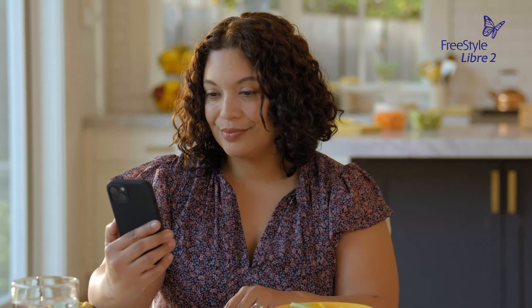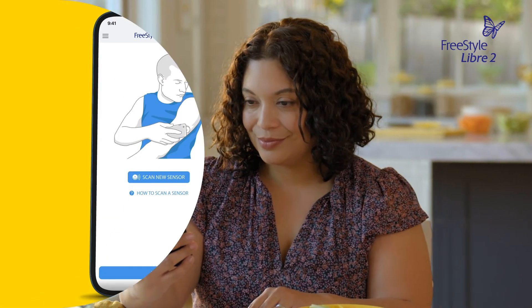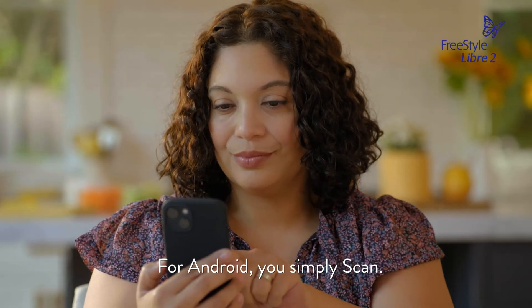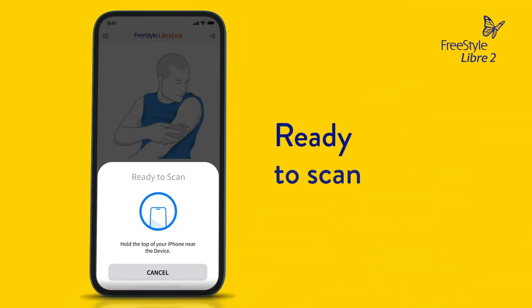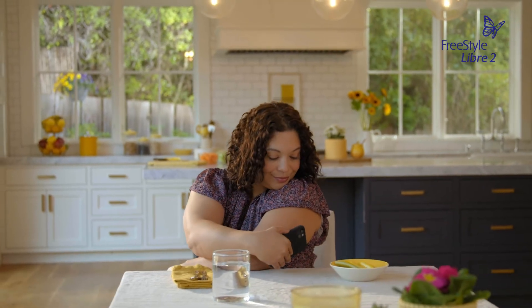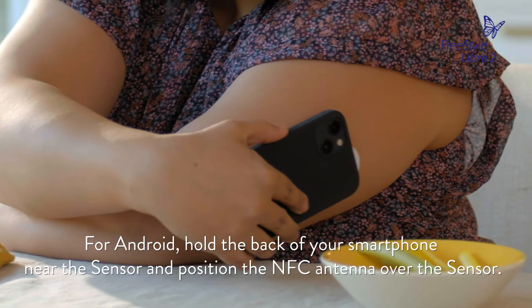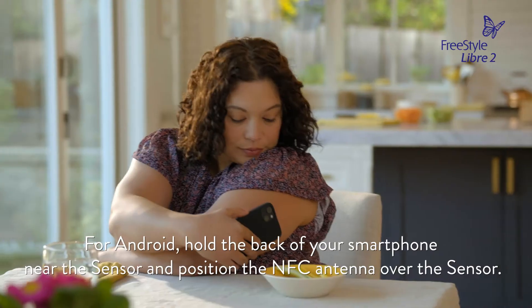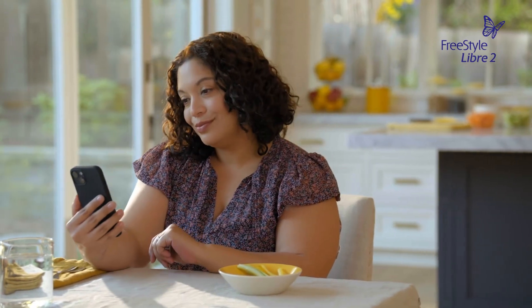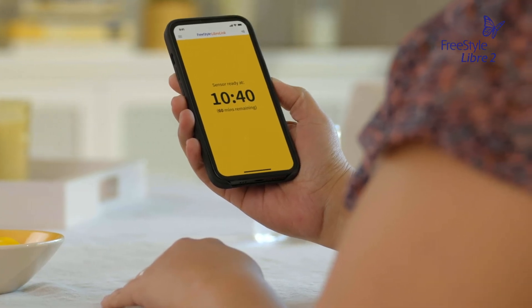To start a new sensor, you'll need to scan it with your smartphone. From the app home screen, tap Scan New Sensor. Your smartphone is now ready to scan the sensor to start it. Hold the top of your smartphone near the sensor — things like proximity, orientation, and other factors can affect scanning. You will receive a tone and vibration after you have successfully started the sensor.